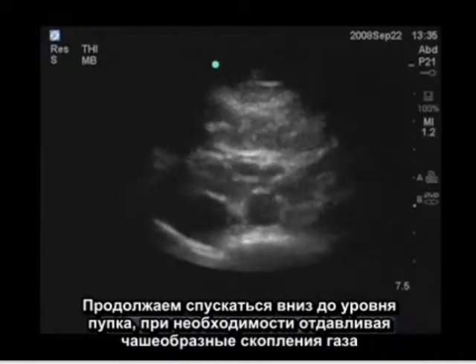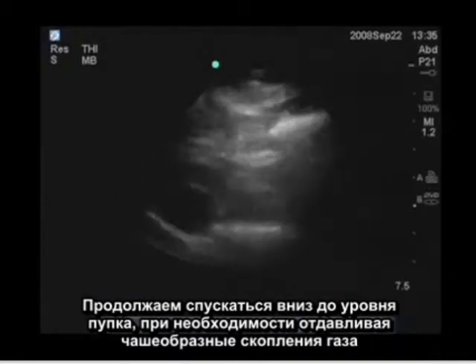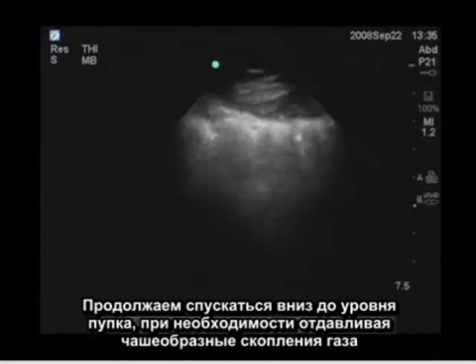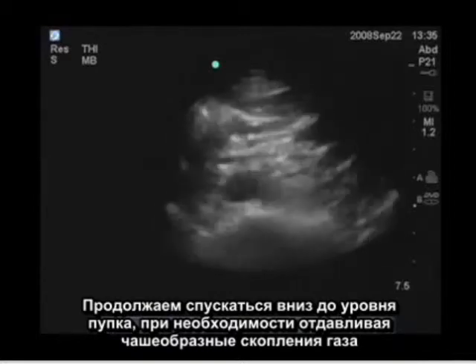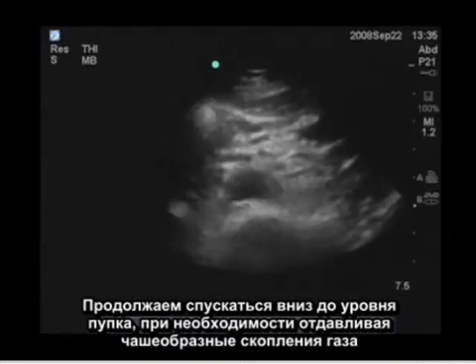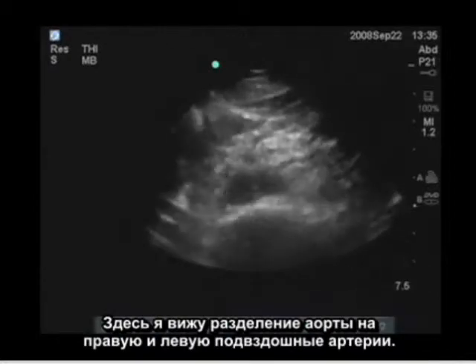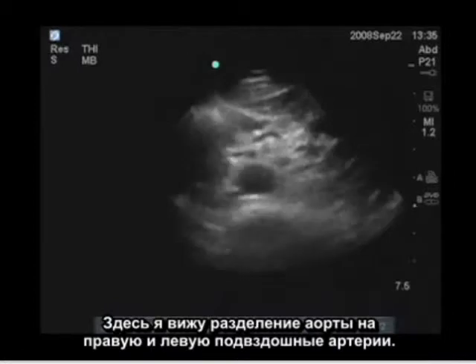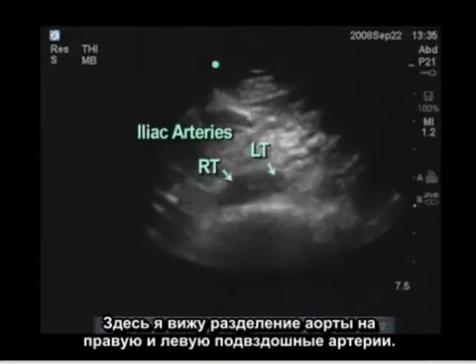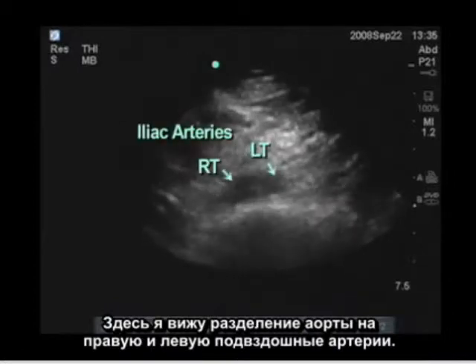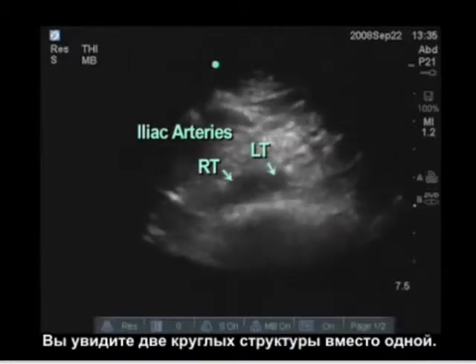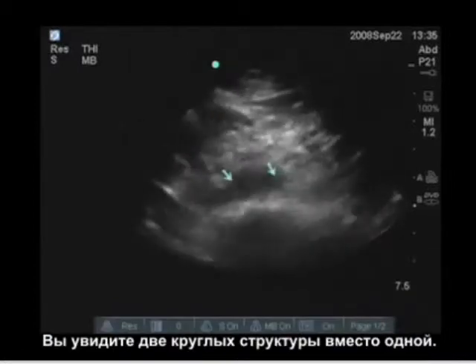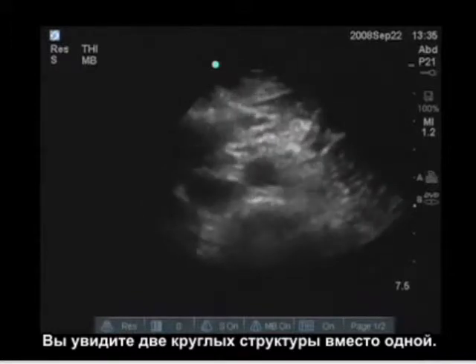I'm going to continue down to the level of the umbilicus, pushing away the bowel gas. Here I see the aorta divide into the right and left iliac arteries — now we see two round circles instead of one.